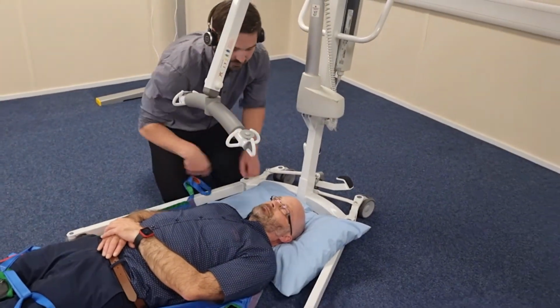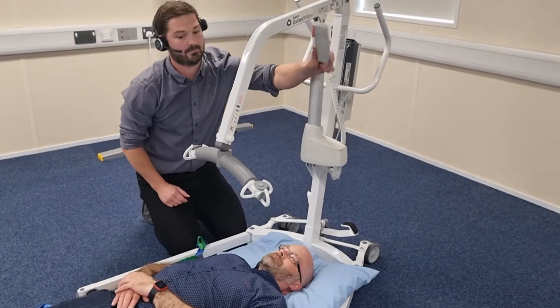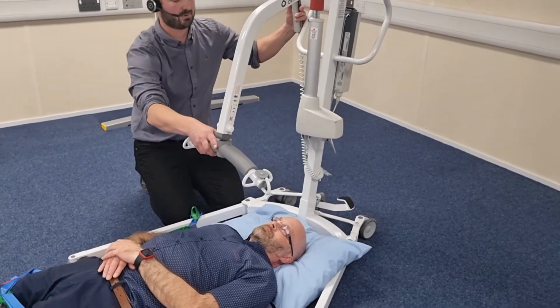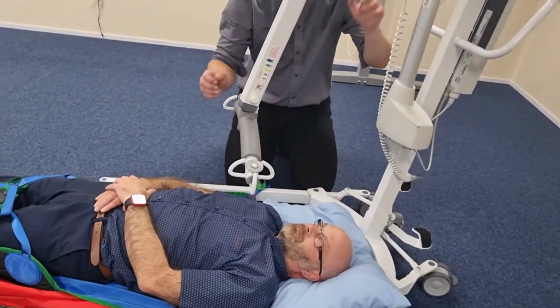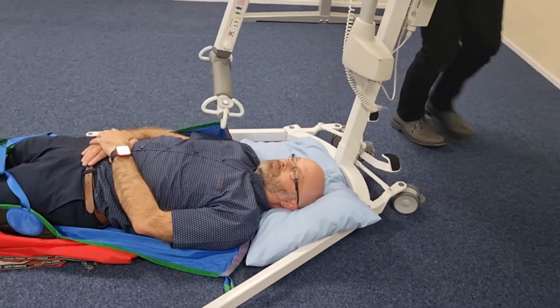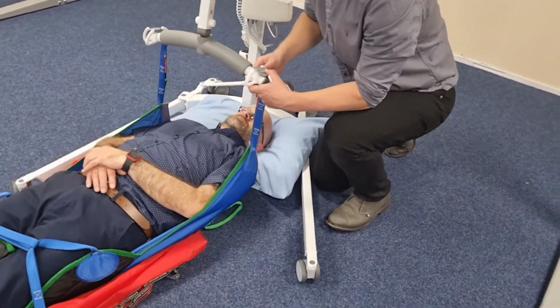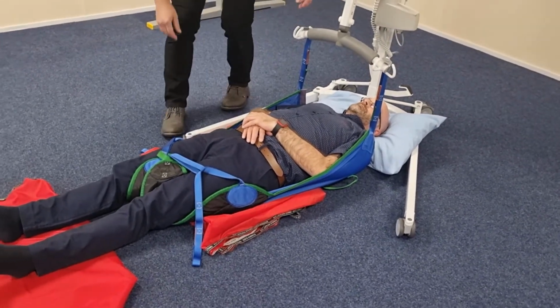I can then look to start attaching the sling to the hoist. Make sure that the carry bar is at its lowest position. Bring it a bit closer. And then I'm just going to attach that one on. Come round and do this one. And then I'm going to attach the leg pieces, the leg loops.